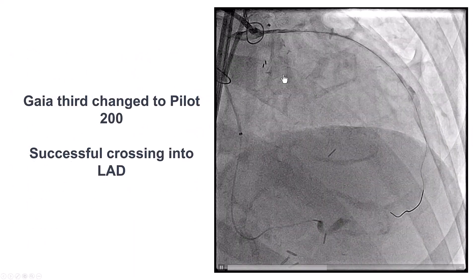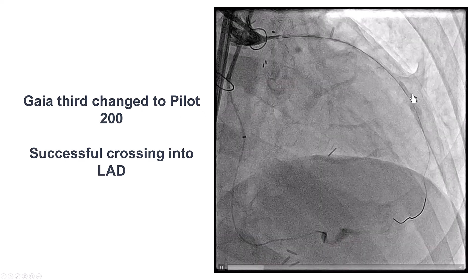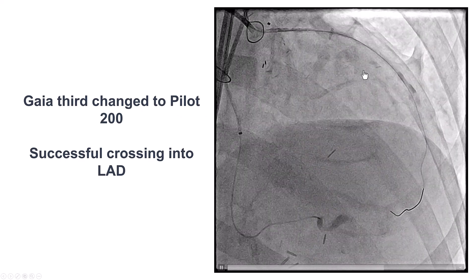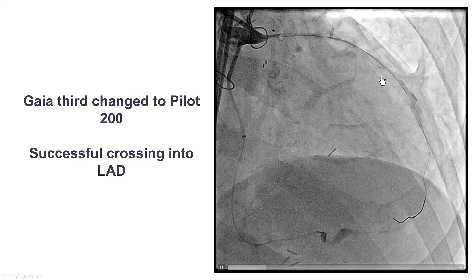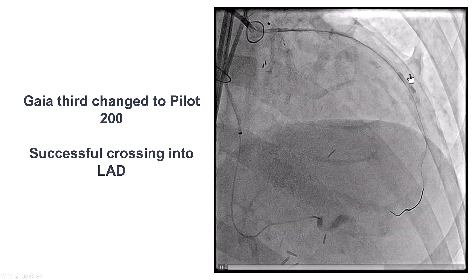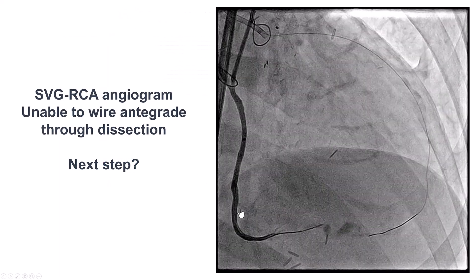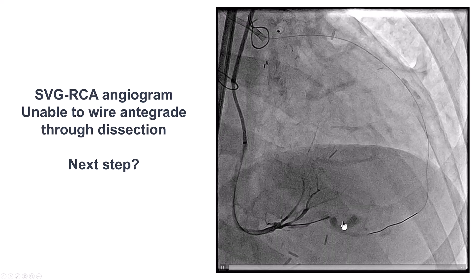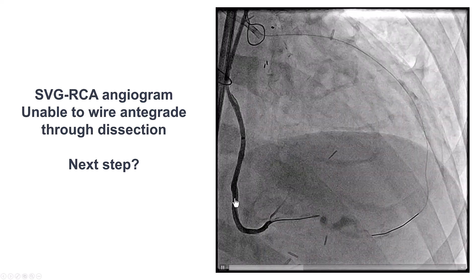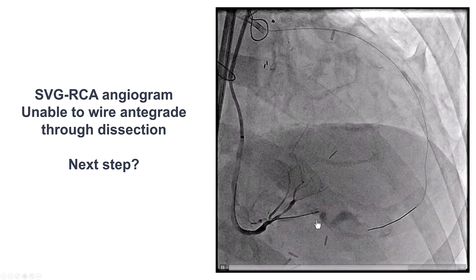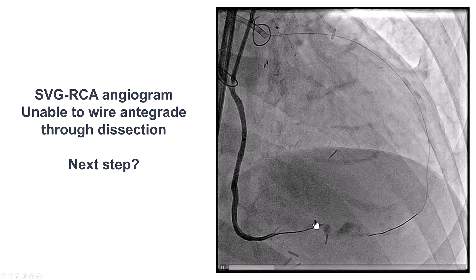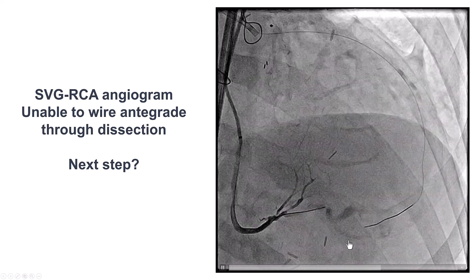We then switched to a PILOT 200 — it is always better to cross the saphenous vein graft with a polymer jacket wire, and PILOT 200 is a commonly used one. This time, the wire successfully went into the distal LAD. Unfortunately, at this point the patient developed chest discomfort and ST-segment elevation as well as depression. We can now see complete occlusion of the right PDA. We tried to wire through that area of dissection, but were unable to do so due to severe tortuosity.